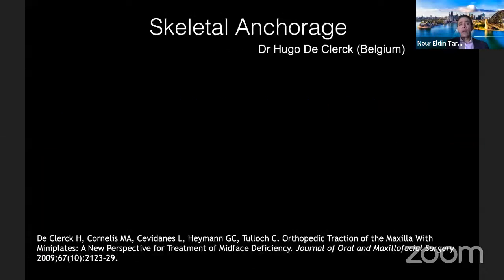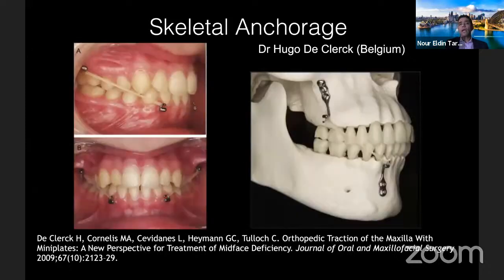The other, and I think this probably was the main game changer, is skeletal anchorage. Skeletal anchorage really offers us a way, and this was Hugo de Clerck's introduction in 2008 and 2009, that you are targeting the area of the problem. You're running your forces directly to the jaws, actually doing true orthopedics.